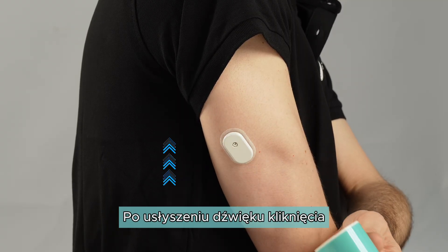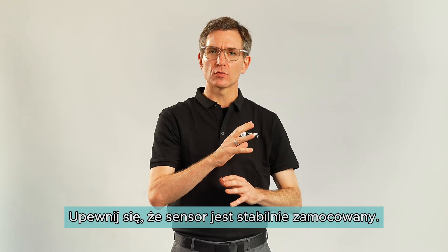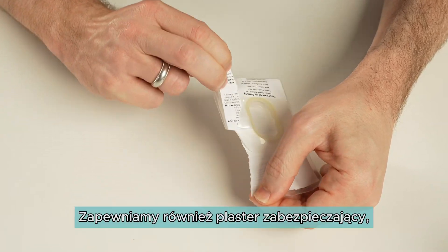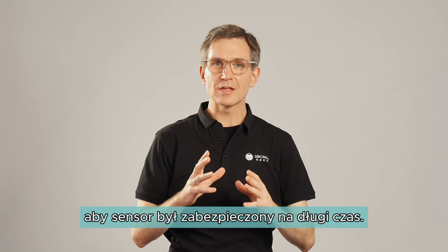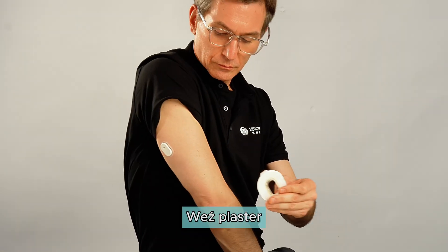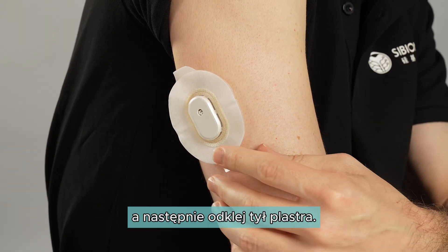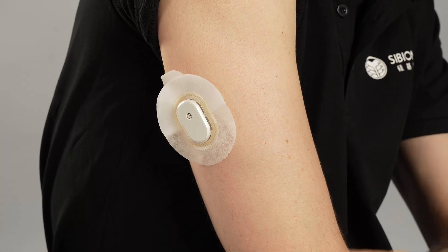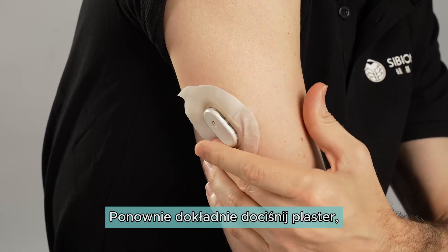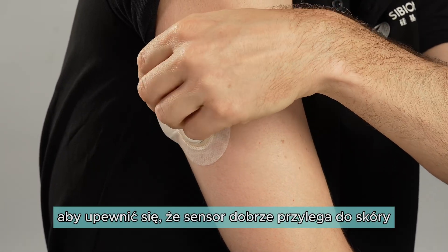After you hear the click sound, pull the applicator away. Make sure the sensor is secure. We also provide an overpatch to help the sensor stay on for longer. Take the overpatch and before peeling off the paper backing, apply it on top of the sensor. Clip in the plastic part over the sensor and when secure, then peel off the paper backing.